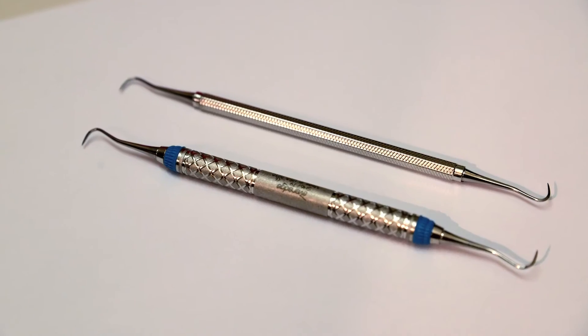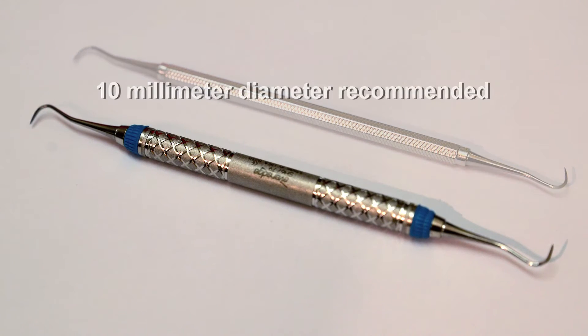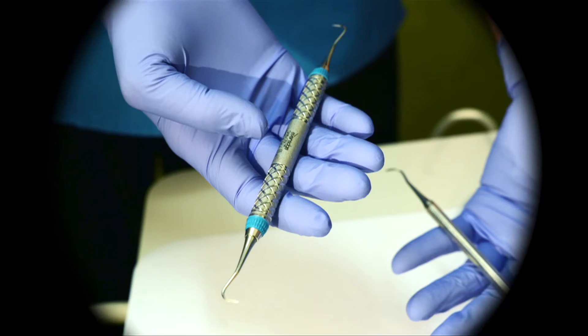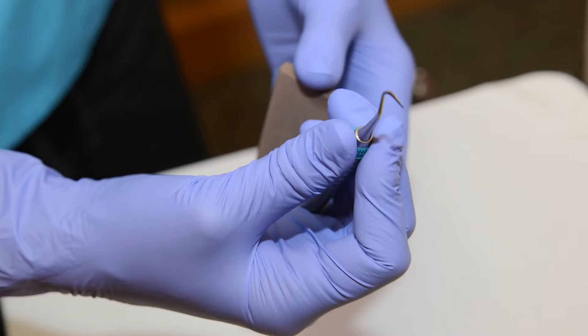The wider the diameter of the instrument — up to about 10 millimeters — the less pinch force is used. Standard instruments with tips weigh 24 grams, and the lighter the instrument, for example 15 grams, the less pinch force is applied.